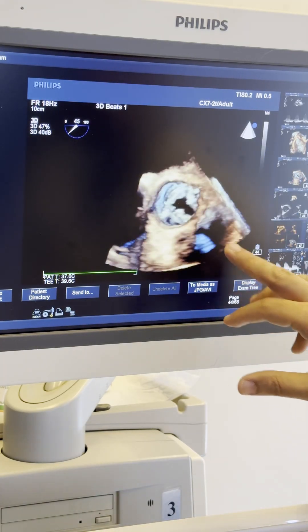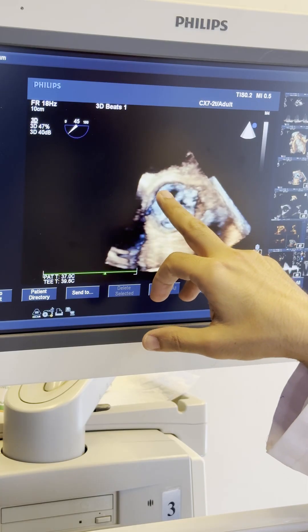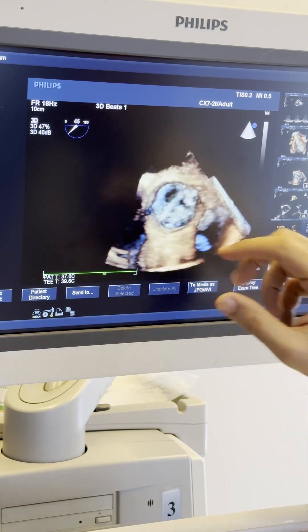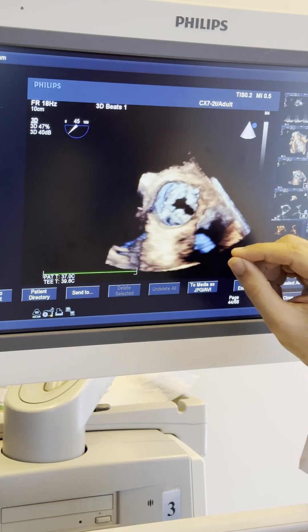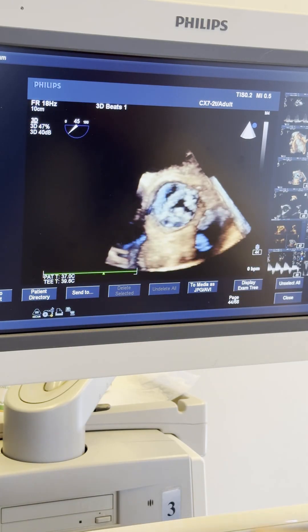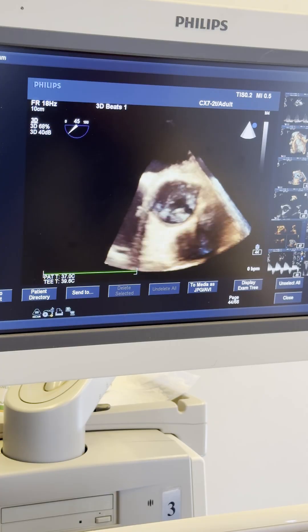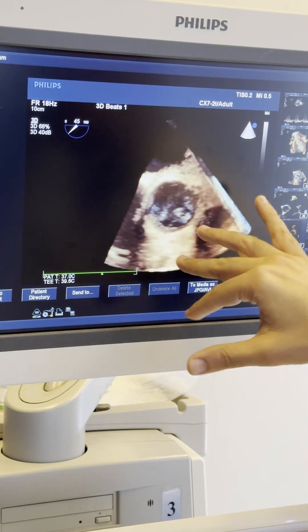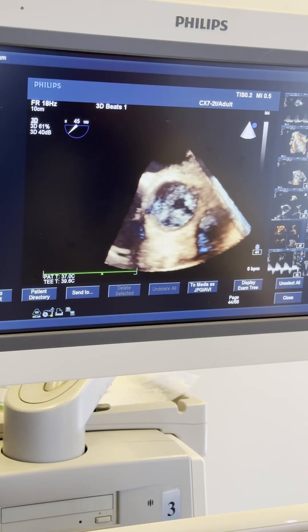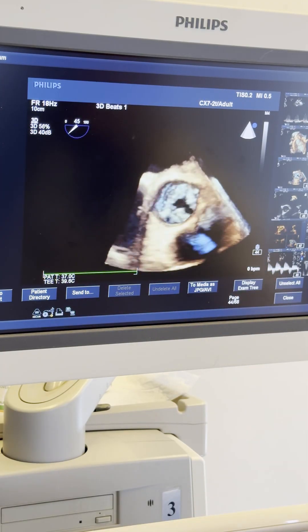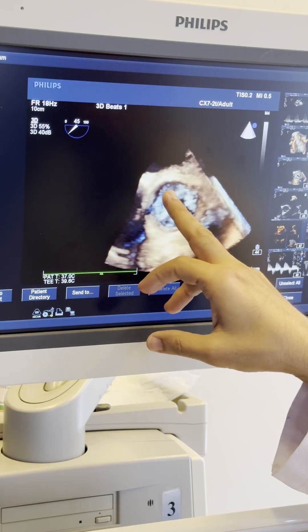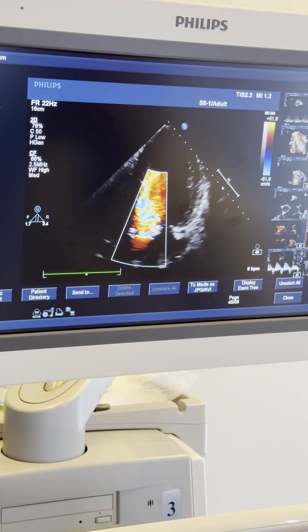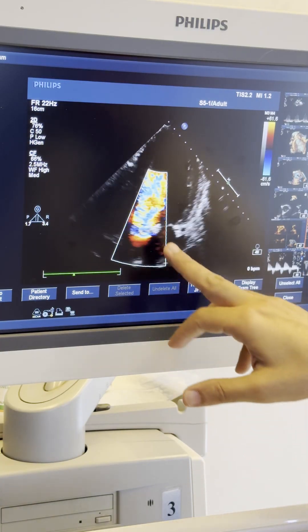Live 3D with color — one of the learning points is to be careful when interpreting dropout artifacts at the basis of the aortic valve. The aortic valve leaflet thickness can reach down to 0.5 mm, so it is very thin. In a calcific valve like this, if you reduce the gain slightly you will get dropout artifacts; but if you increase the gain to eliminate the dropouts, you will hide the image behind the brown signal of blood intensity. If you decrease the gain you have a better view of the valve but a dropout artifact at the basis. Be careful — this is not a perforation; this is very common in the aortic valve.